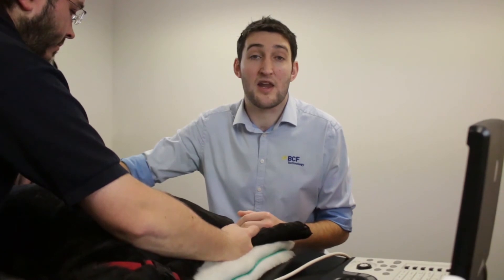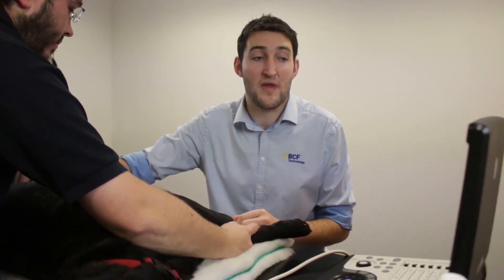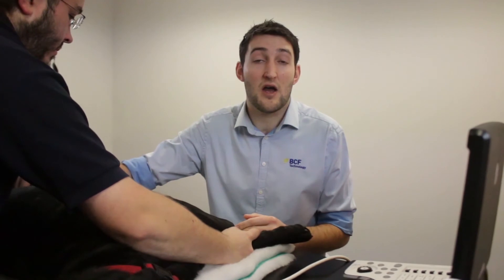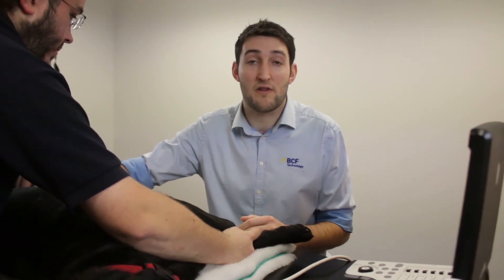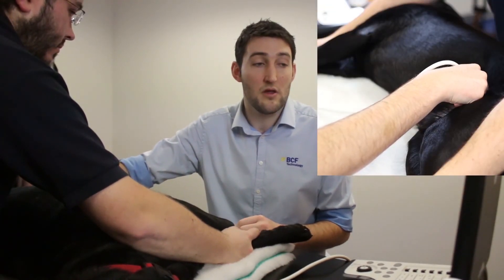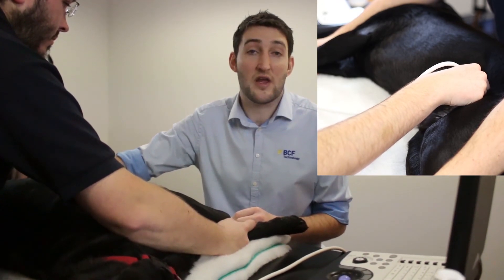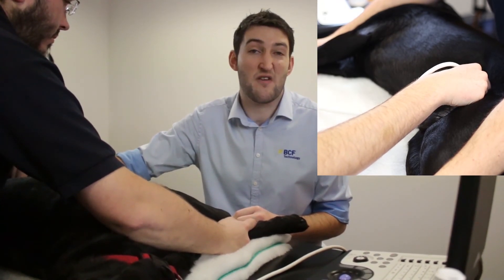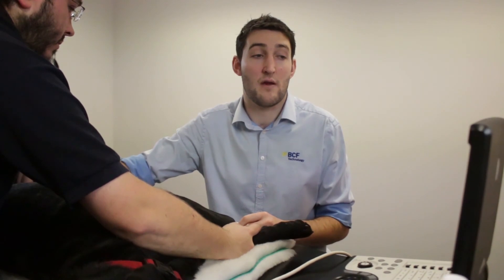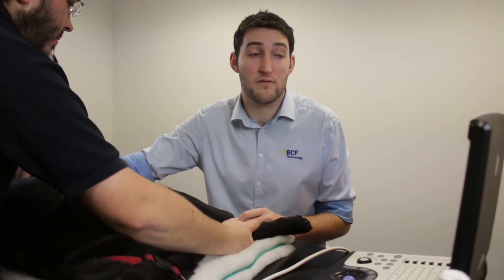Normally you can see that again as an anechoic triangle. As before, if you have any fluid there visible then that's considered to be a positive response. Fortunately in this view we have very little in the way of negative or false positives, so it's fairly obvious if it's negative and it's usually correct.